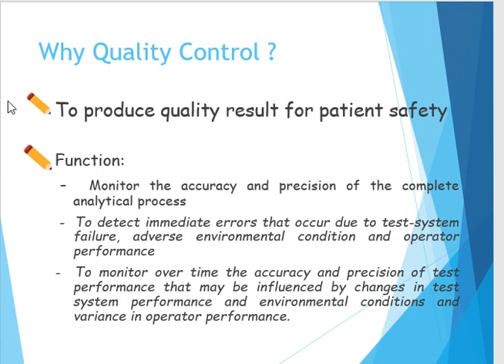So why do we need to perform QC before or during analyzing the patient specimen? It is because we want to make sure that all patient results are correct or accurate. So it is to produce quality results for patient safety. For example, if the patient has end-stage renal failure and needs to be on dialysis, however the lab produced a normal renal profile instead of abnormal, this will lead the doctor to not perform the dialysis on the patient and could endanger the patient's life.